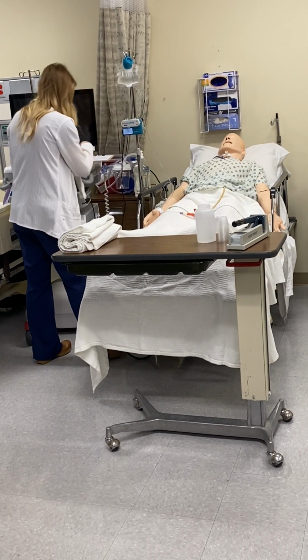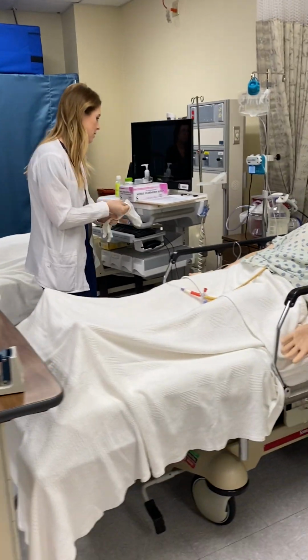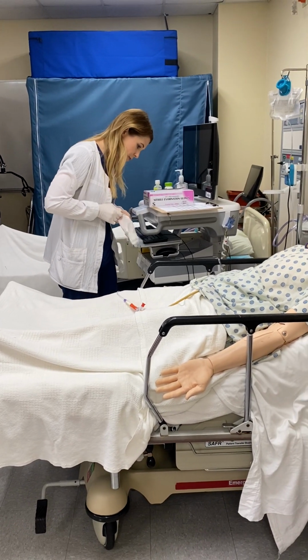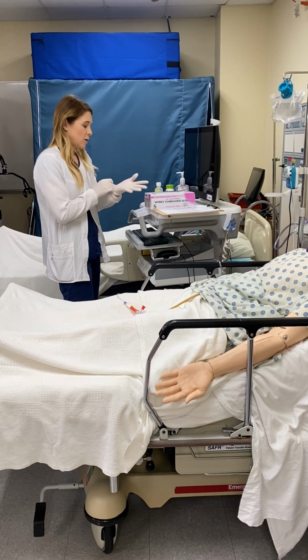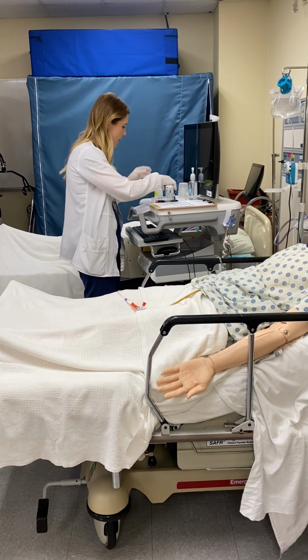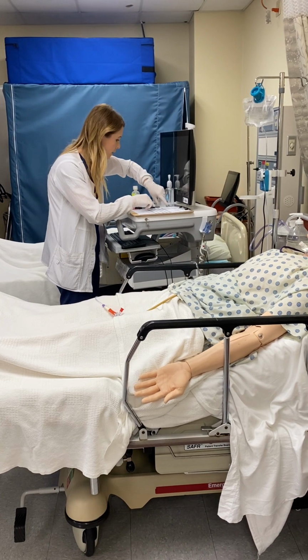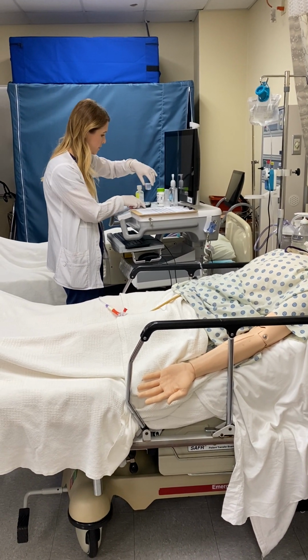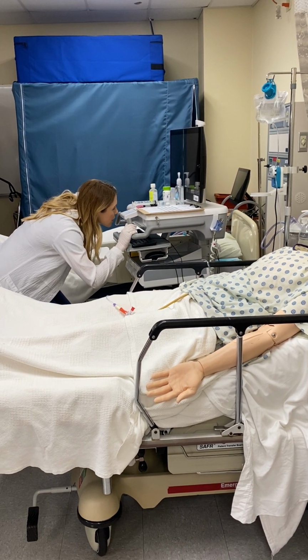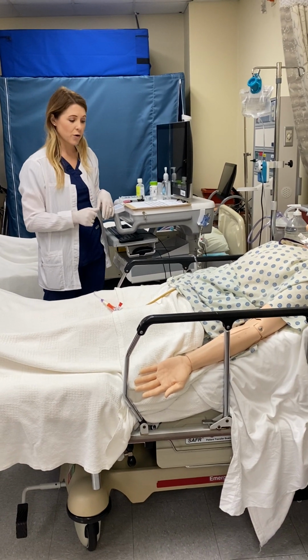Mr. John Smith. Okay, that's who you are. And your birthday is 1/25/46. That's accurate. Do you have any allergies? Not that you know of? Great. Okay, so we're going to proceed. Since I'm at the bedside, I'm going to do my third check. I've got folic acid 1 milligram, mixed in 10 mLs of water, and that's for you, Mr. John Smith. And then I have a multivitamin, 30 mLs, and that's for you again, Mr. John Smith, and both are going the route of your PEG tube.